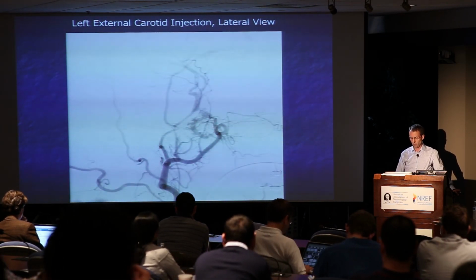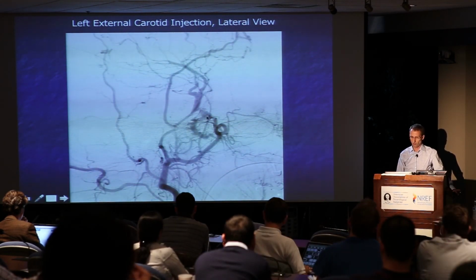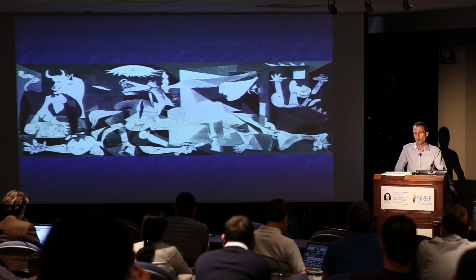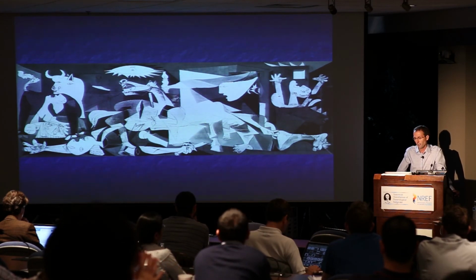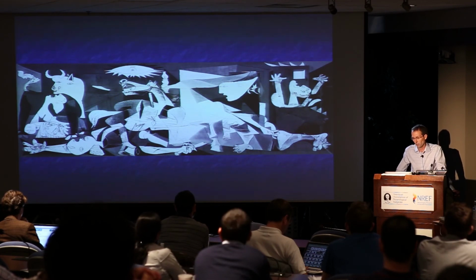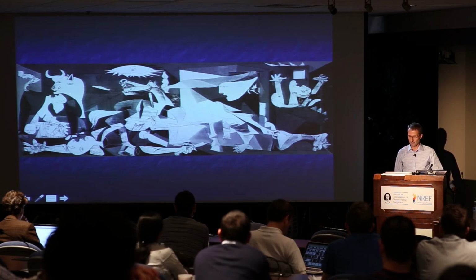And if you're like me, when you see something that looks like this, there's obviously something interesting going on in this area. But my initial thought process when I see something like this is: it seems sort of cool, it's a little bit bizarre, it's sort of fascinating to look at. And then after that initial impression passes, I realize that I'm not real sure what the hell is going on. And I sometimes feel like this guy over here. So the dural fistula anatomy can be extraordinarily difficult to evaluate and to treat.